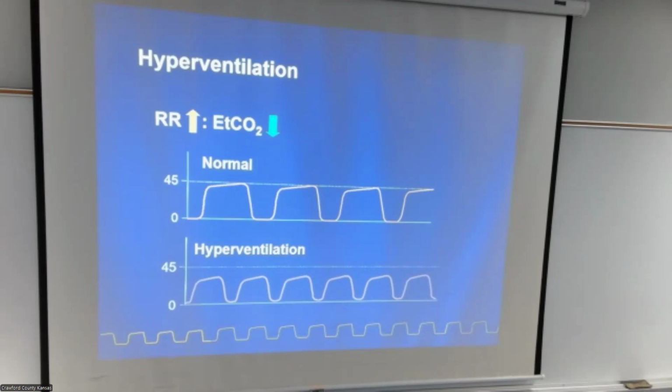And that's one way we can tell how quick your patient's breathing. If you don't want to sit there and time them out, throw them on CO2, and it'll tell you right there how quick they're breathing. Count them out.